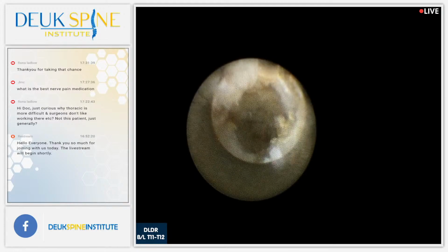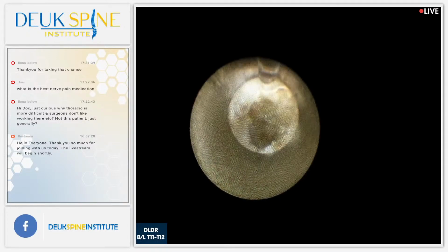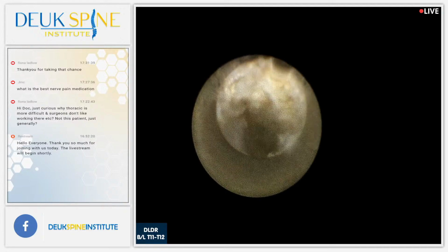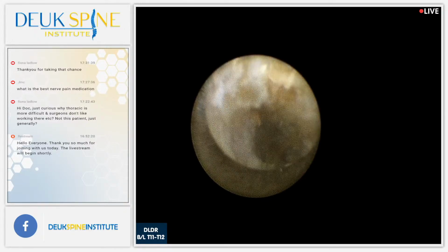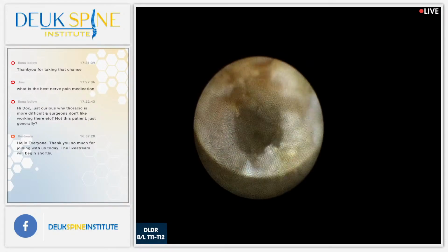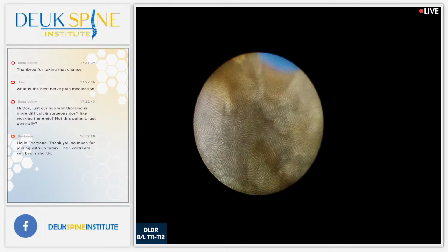But the reality is you're right. Other doctors won't do it. So the patients suffer. And I don't want people to suffer for something I can fix. But yeah, it's a dangerous area because of all the spinal cord and the nerves and the lung and the lymphatic system and the blood vessels. And it's really hard to get to. But we're actually going through a small hole in the side of the spine to get to the disc. It's called transforaminal. And I guess I just could say that I feel comfortable enough to do it.